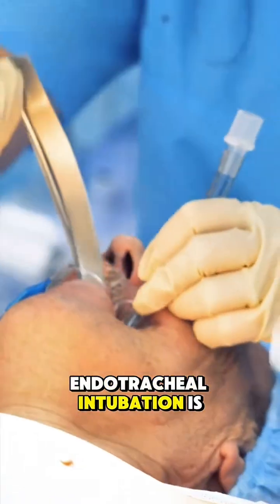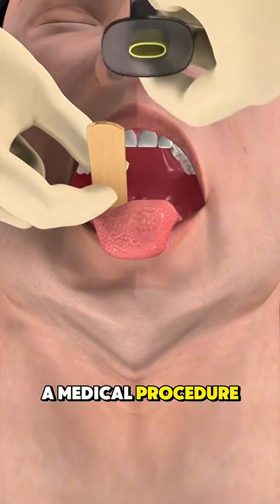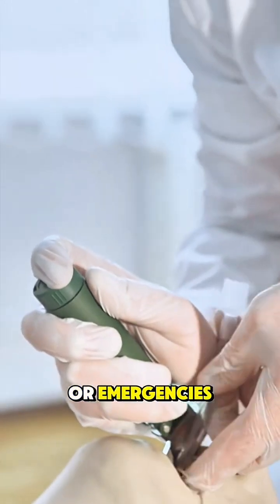Ever wondered how endotracheal intubation is performed? Endotracheal intubation is a medical procedure used to help patients breathe when they can't do it on their own, especially during surgery or emergencies.